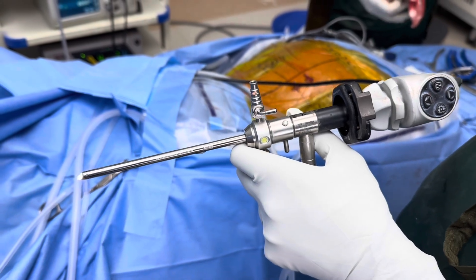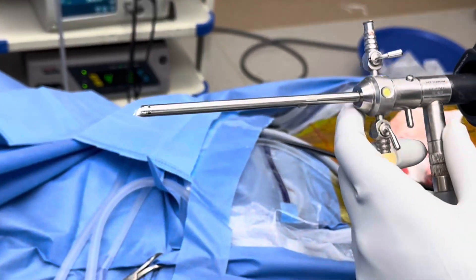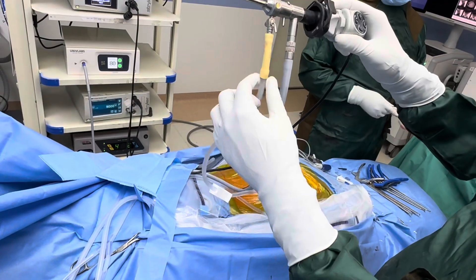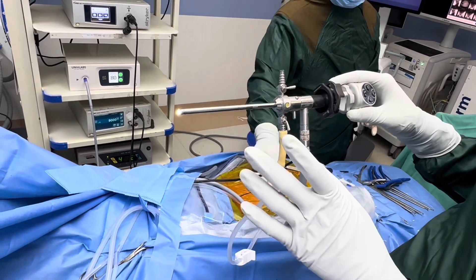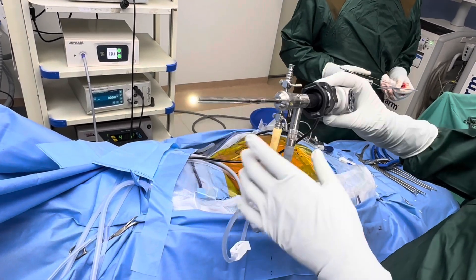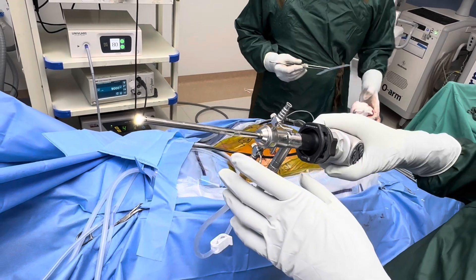We can see it on the screen and then we do a discectomy with this surgery. This is the light source that has been used, this is the camera, and this is the water medium that we use. The beauty of this surgery is it is a minimally invasive spine surgery done through just a 7 millimeter incision, so the cut is almost negligible.